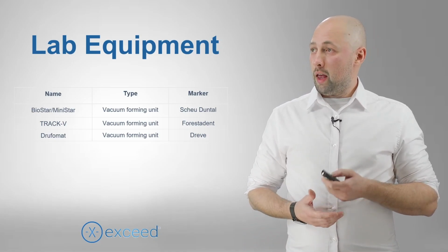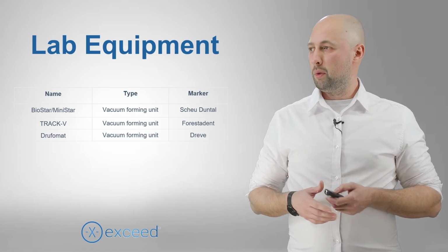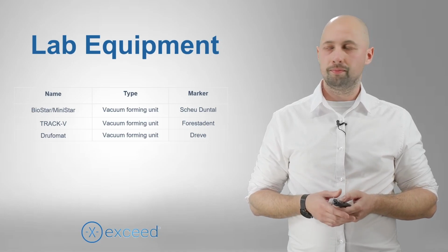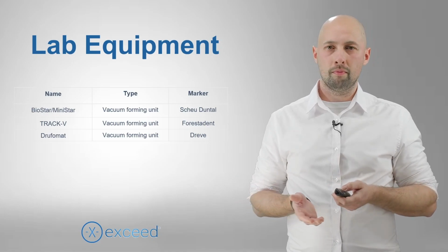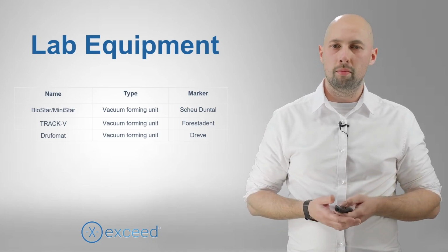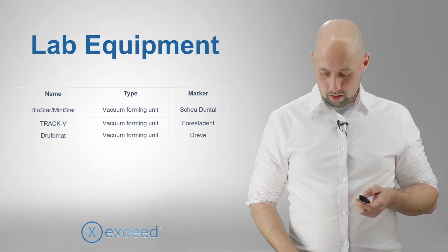Also in the lab equipment, we have a micromotor, so you can cut and polish the aligners, but they're pretty common. We use Marathon, for example. This is the machine that we use.